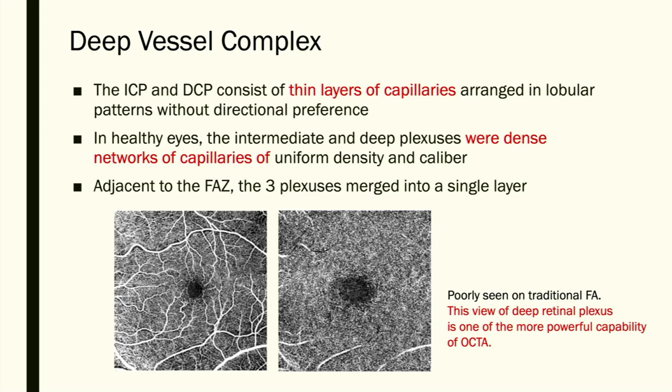It's the same vessel which is in the superficial plexus that is sometimes seen down also. This is an artifact, as the superficial vessel which should not have been seen in the deep layer is also being seen. Once you start seeing it, you will know that that large vessel does not belong to the deep plexus. The deep plexus looks only like fine small capillaries. Okay?